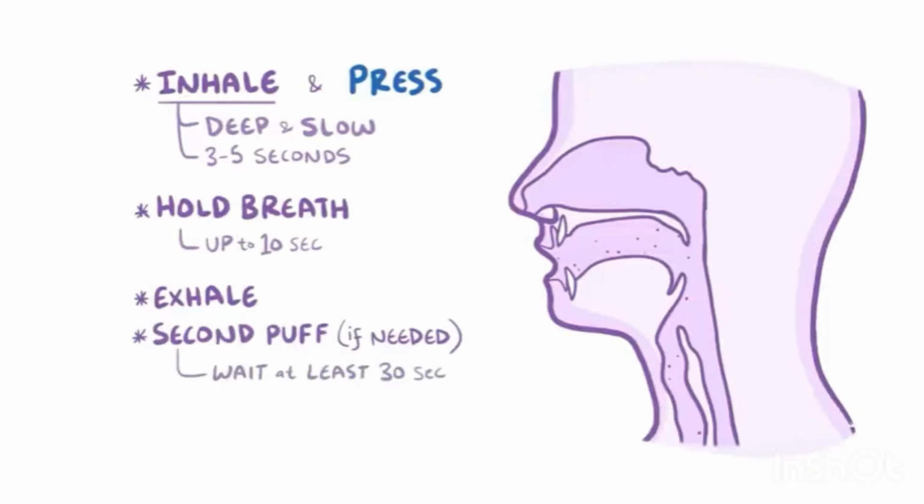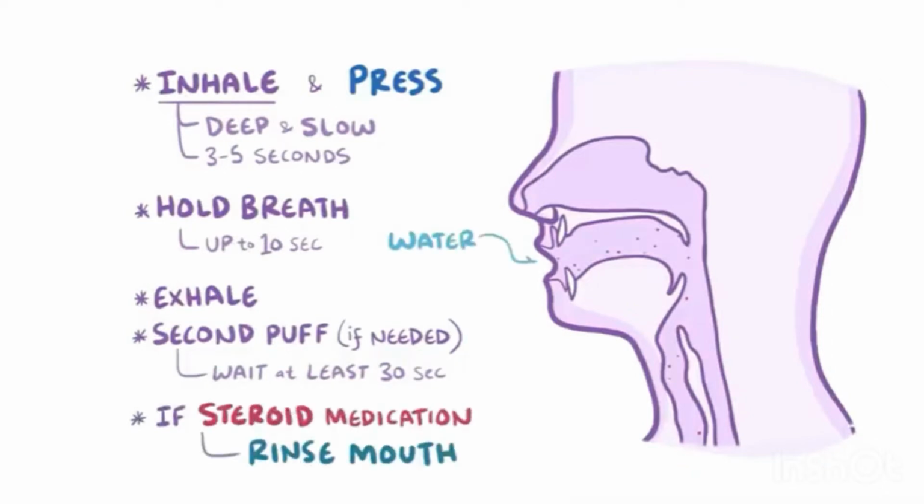After you're done, if the medication is a type of steroid, rinse your mouth with water. Swish, gargle, and spit. Don't swallow the water. This prevents any excess medication from staying on the inside of your mouth.